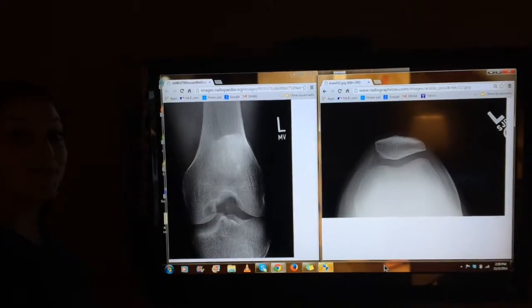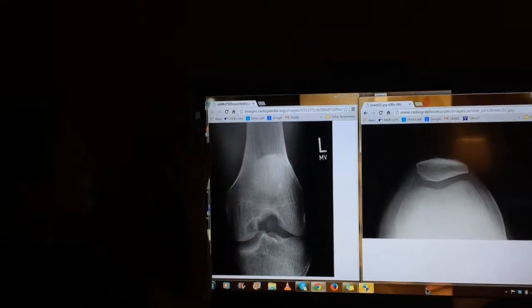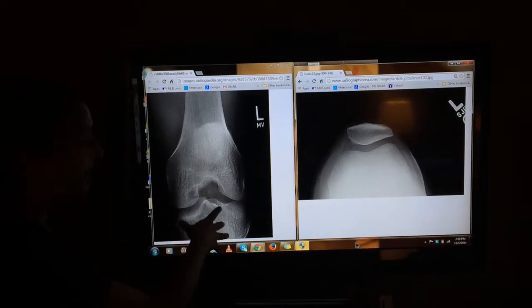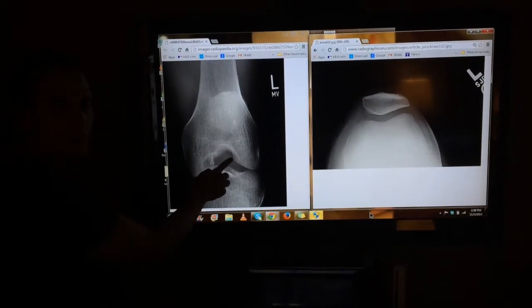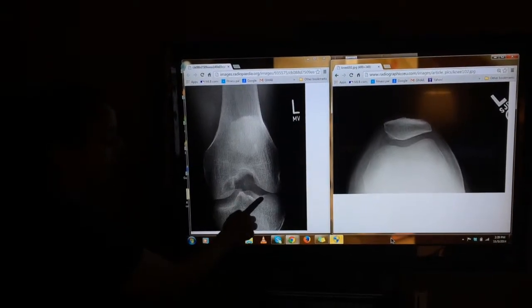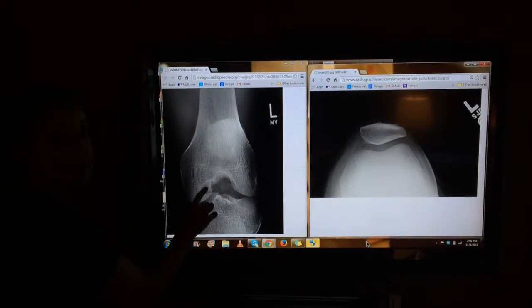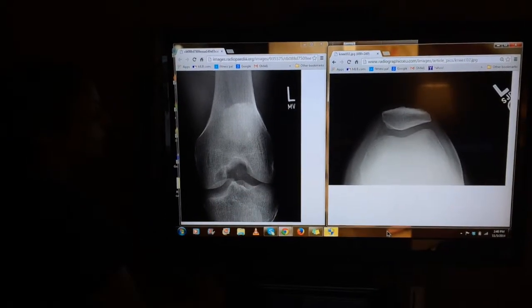Okay, so these are our two remaining views of the knee. These two views were not done in the Bucky, these were done outside the Bucky. The first view we have is the intercondylar fossa. It's the AP axial view. It's also known as the Beclere method. Because it's the intercondylar fossa view, the intercondylar fossa is completely open and it looks great. We also show the intercondylar eminence beautifully there, as well as the tibial plateaus. The joint space is open, and since the knee is flexed, you can see the inferior side of the femoral condyles, which look great there.